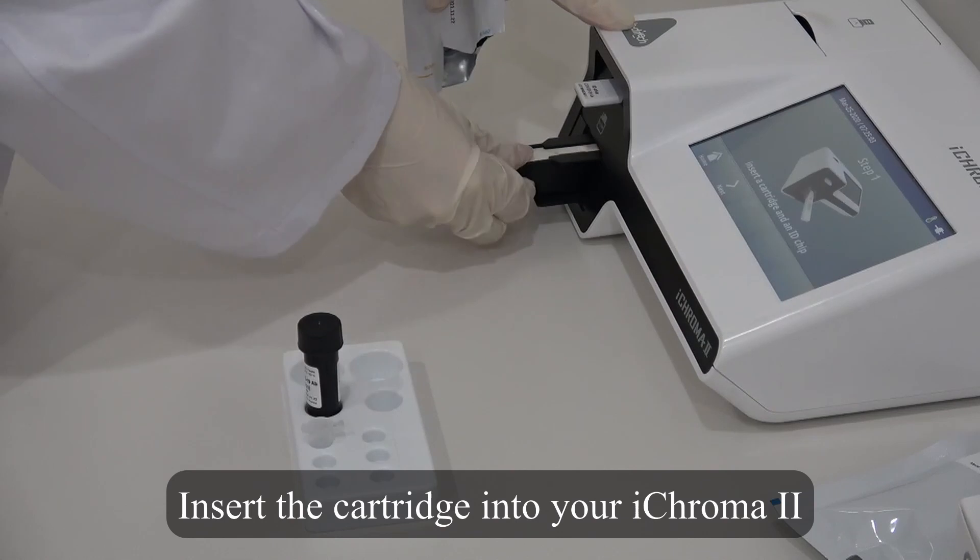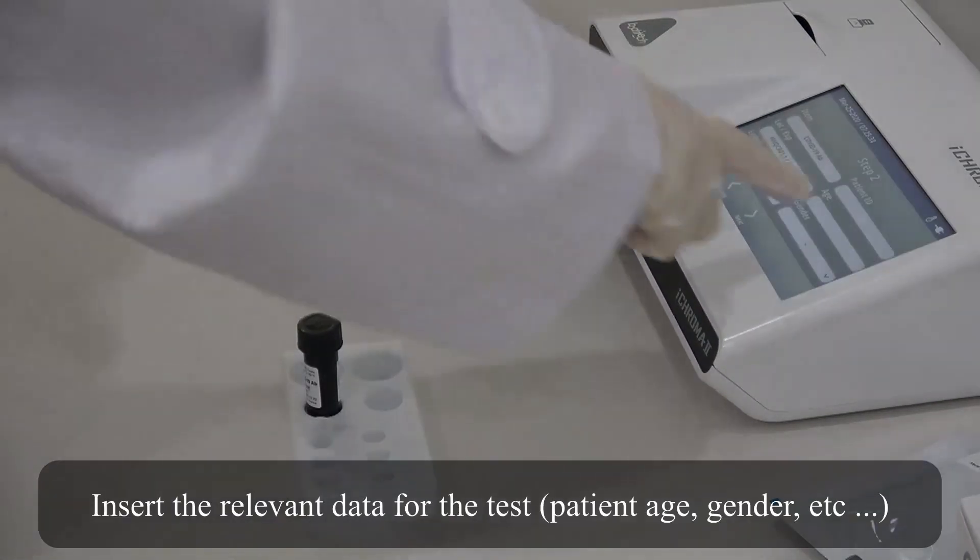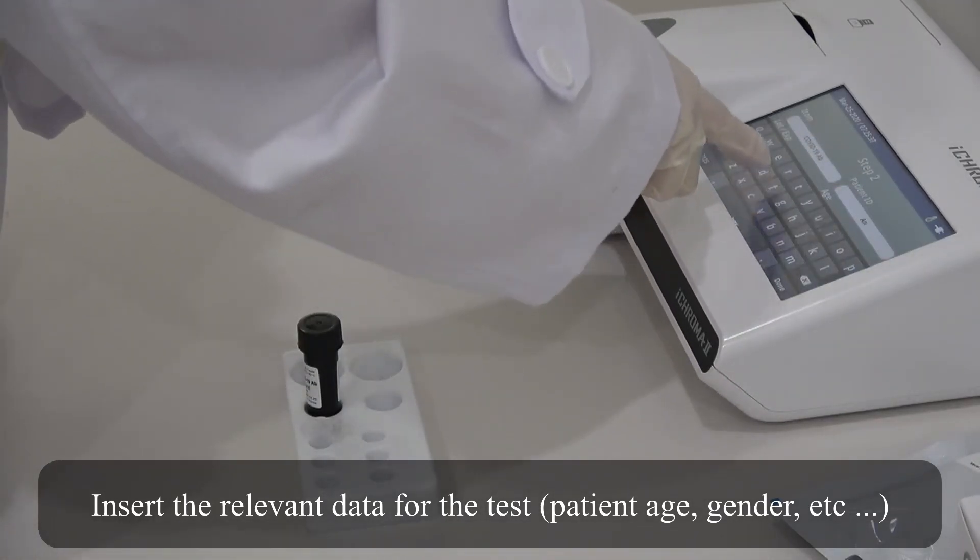Insert the cartridge into your iChroma 2. Insert the relevant data for the test: patient age, gender, etc.